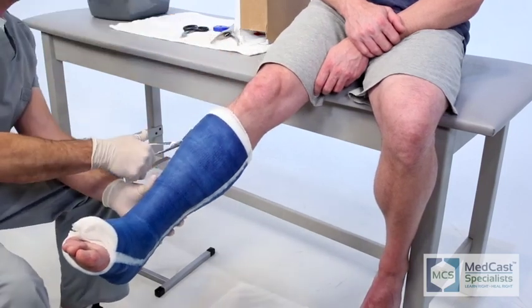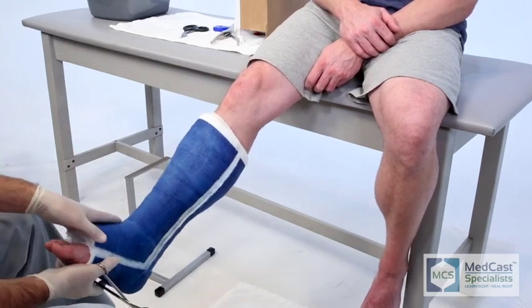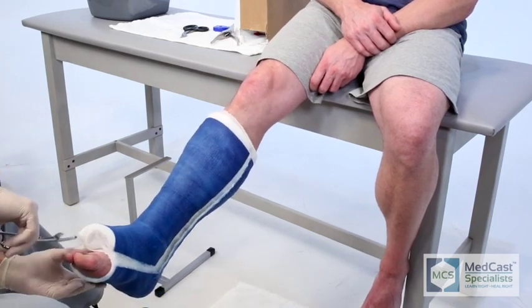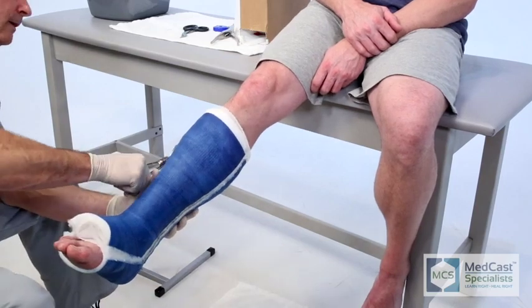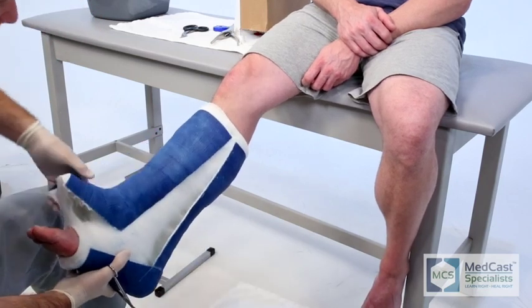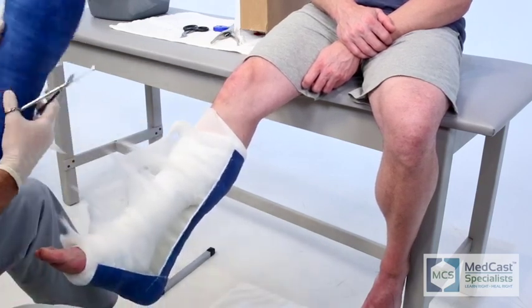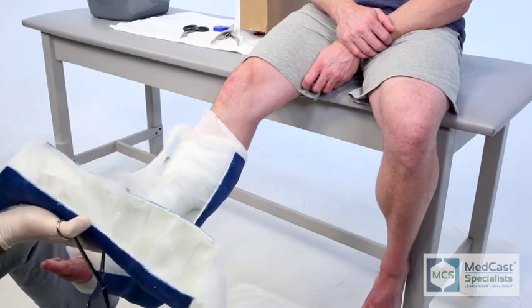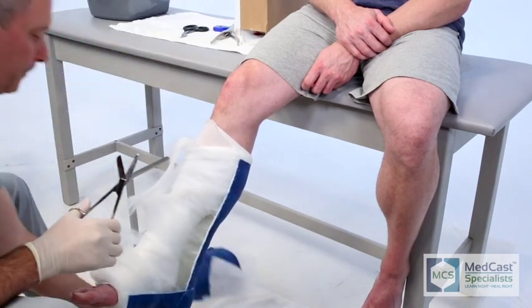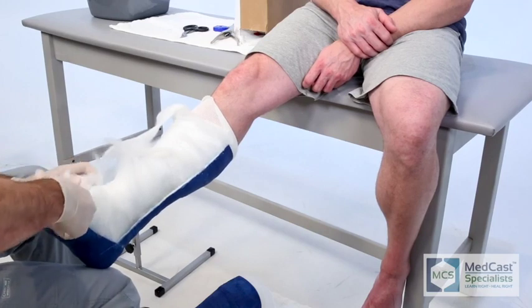Lance is cutting all the stockinette off the distal and proximal sides. This allows you to just pull that half of the cast off pretty easily and it avoids using the scissors on the malleoli and hitting into them. The skin is so sensitive that you drag scissors across it at the wrong angle and you can actually make them bleed.